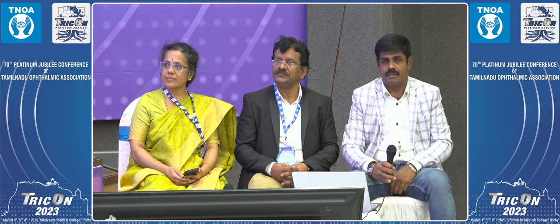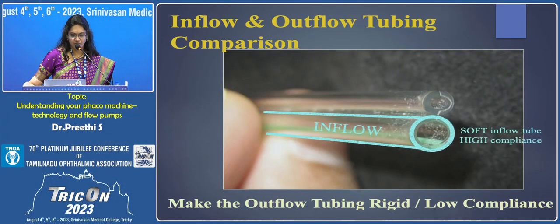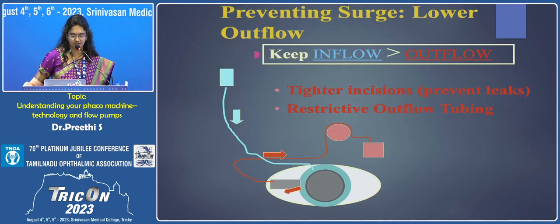So this is the surge. One thing which I want to tell you is to make sure the inflow is always greater than the outflow to prevent the surge. And we have to use more non-compliant tubing for the outflow so that the surge is prevented.